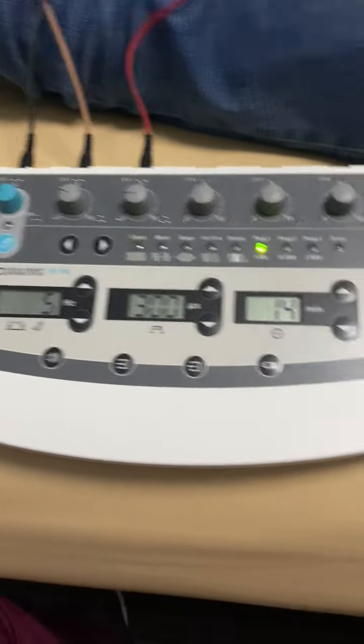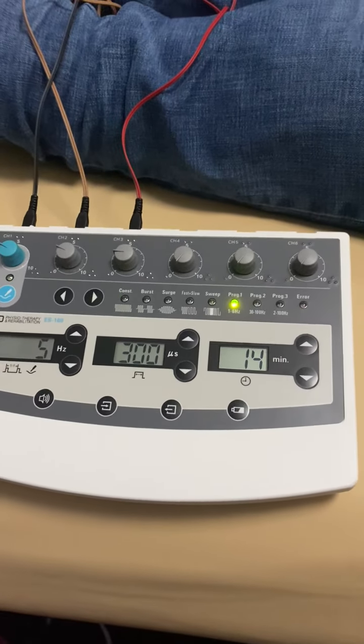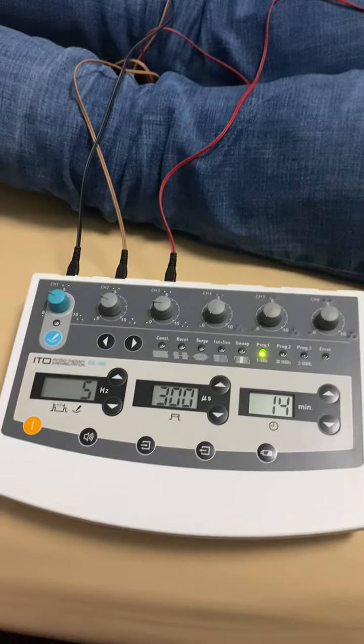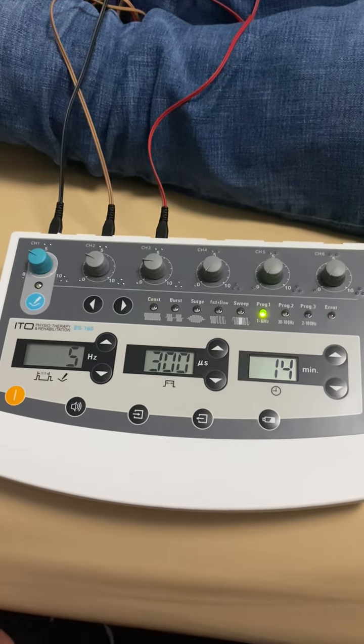We got ourselves an Edo ES160 — this is a stim unit that allows up to six leads. We got it from iDry Needle. We switched from TENS units; it's much more comfortable for the patients.